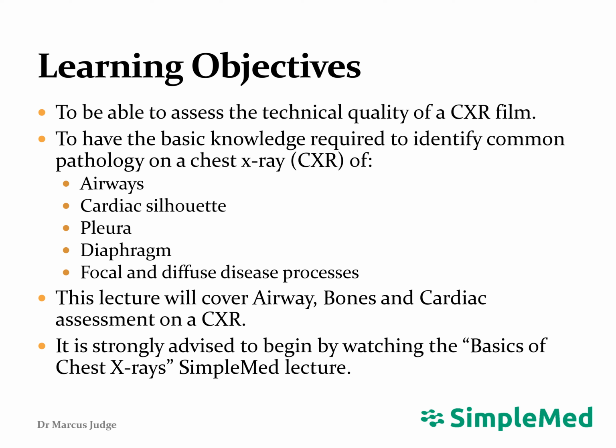Our previous lecture on the basics of chest x-rays gives a good base to understand this lecture, and so we recommend that you check that out before watching.